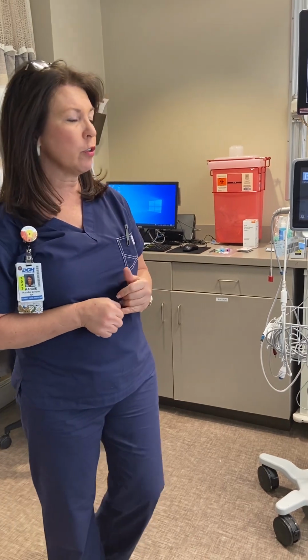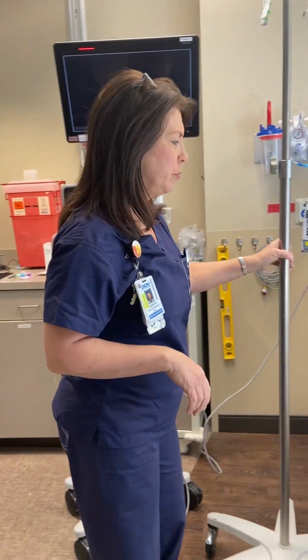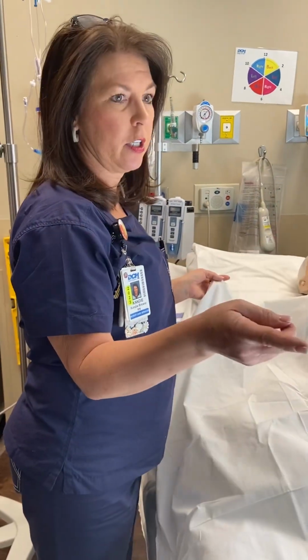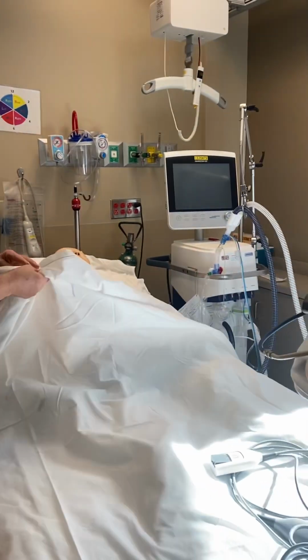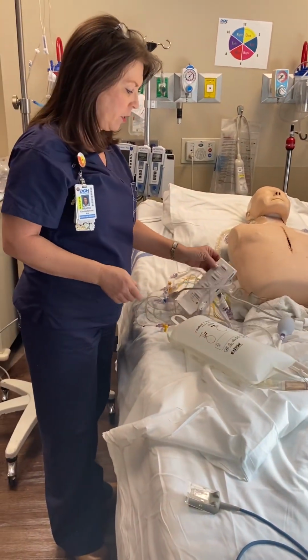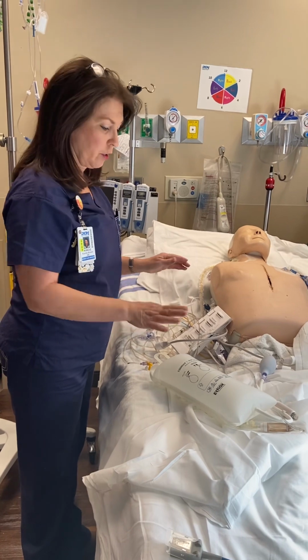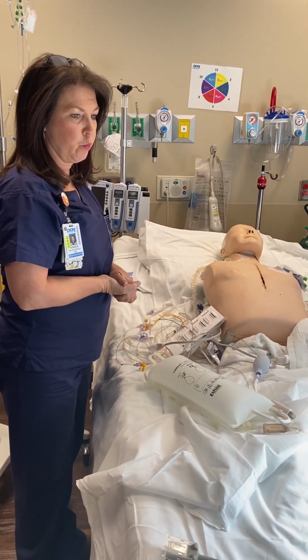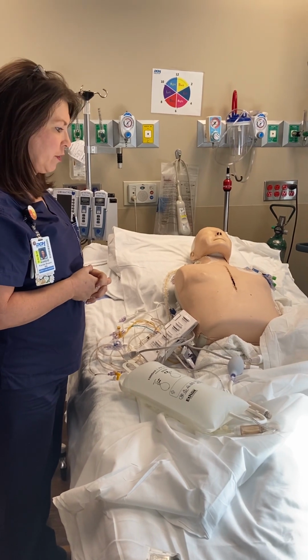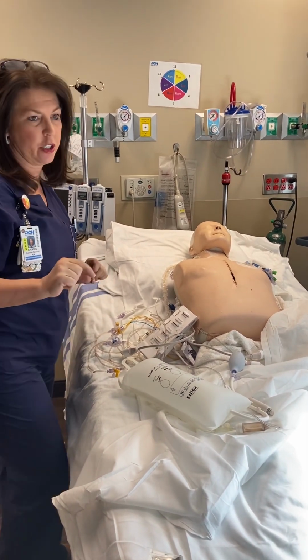So once the case is rolled in the room, so Mr. George is rolled in the room, he typically just has a sheet on him. You'll have your monitor at the end of your bed, and then when you pull the covers back, you're going to have your transducer and your flush system. So you have a primary nurse and you have a secondary nurse, and each has their own roles of what they're supposed to do. We'll discuss that in just a second.